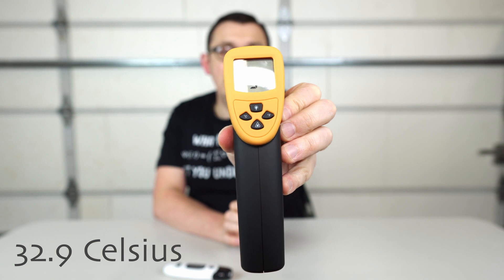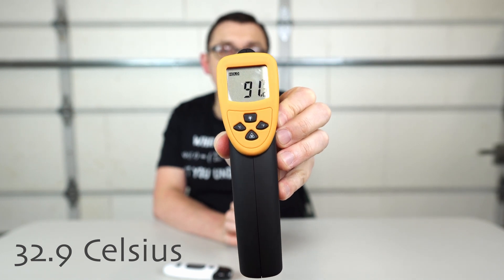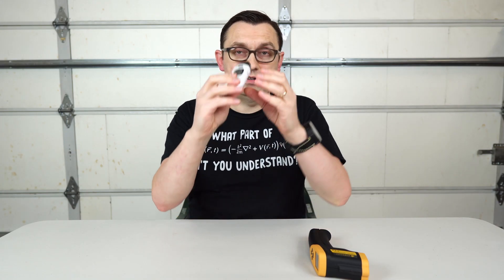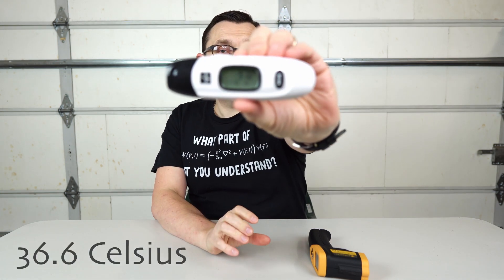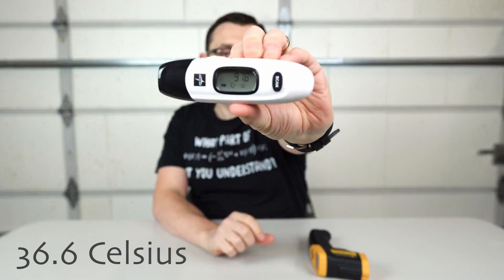Look at this. 91.2 degrees Fahrenheit. Well, let's check temperature with this thermometer now. 97.8 degrees Fahrenheit. Look at this. So it's actually a big difference.